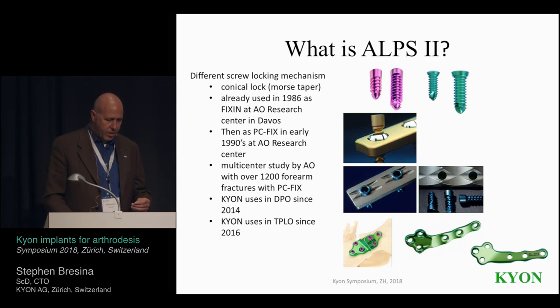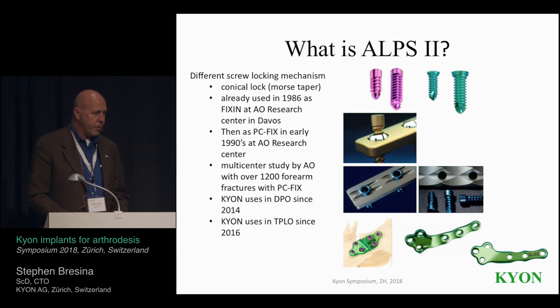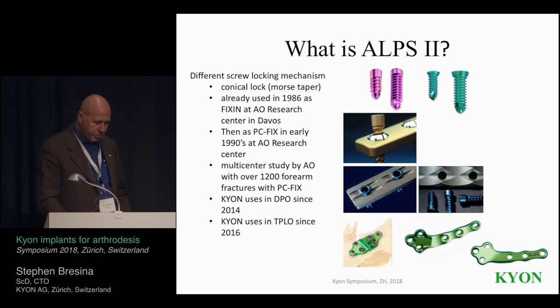And that's kind of evolved from work that was done in AO in the project called Fix-In in 1986, where you had these little rotational eyes in here that would allow the screw to angulate. Then it was decided, well, if you're going to lock the screw to the plate, you don't need angulation because the bone is going to be right below the plate, so you can go with the short monocortical screw. And that's how the PC Fix ended up being developed. And now we're going back to that.